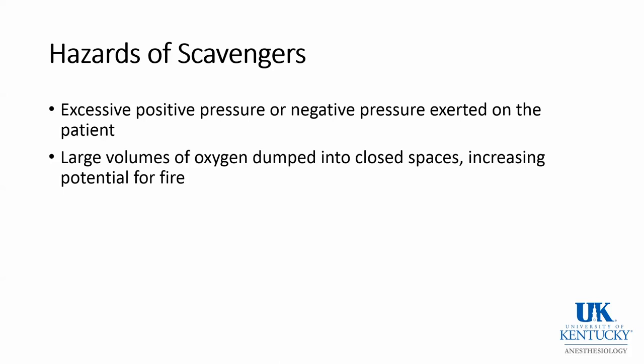This last statement relates to the oxygen from anesthesia machines ending up in an enclosed space in a hospital rather than being vented to the atmosphere through a pipe going through the roof, for example.